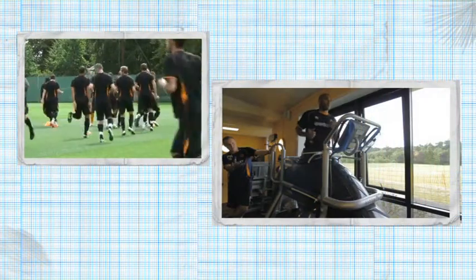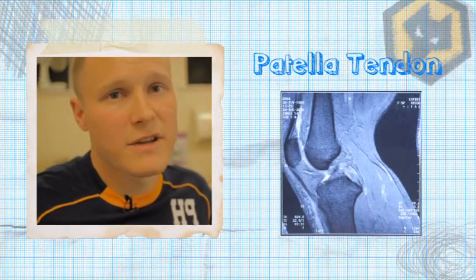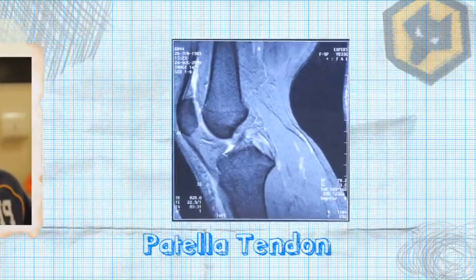Ultrasound is great for looking at footballers' knees. Knee injuries are all too common. And by looking into the tissues using ultrasound, physios can not only help players get better quicker, but change their training program so the problem doesn't develop in the first place. Tendons tend to be the biggest issue that we use the ultrasound scanner for.